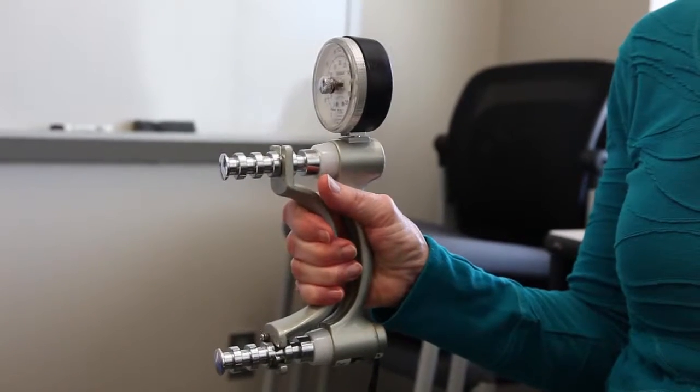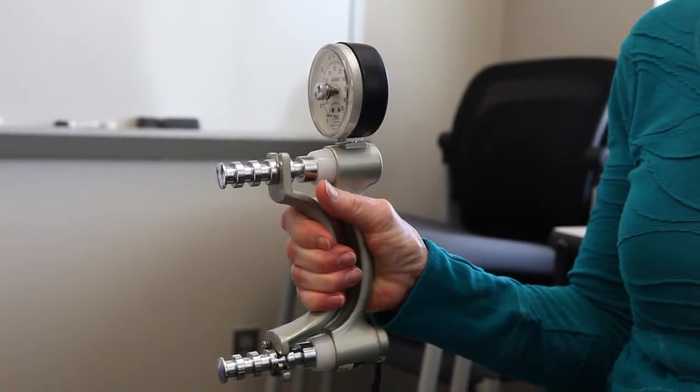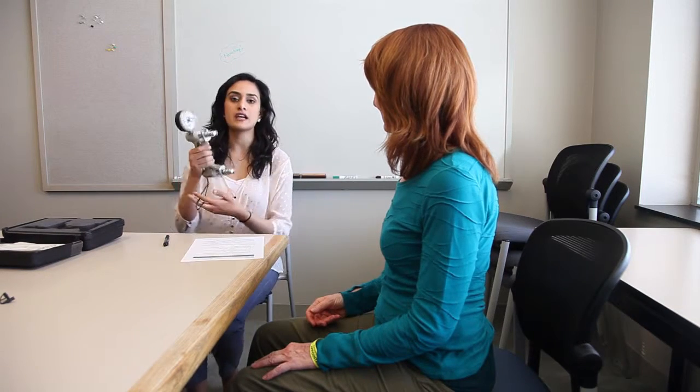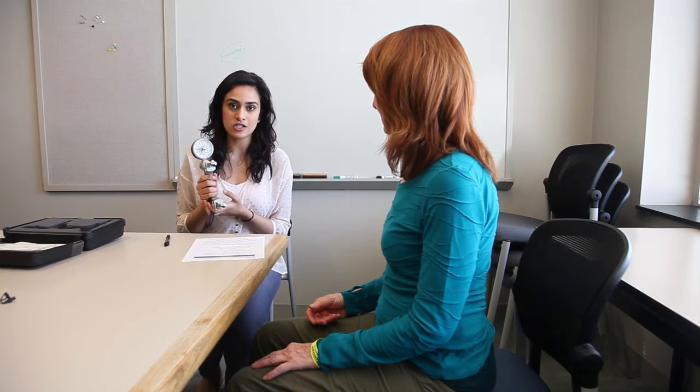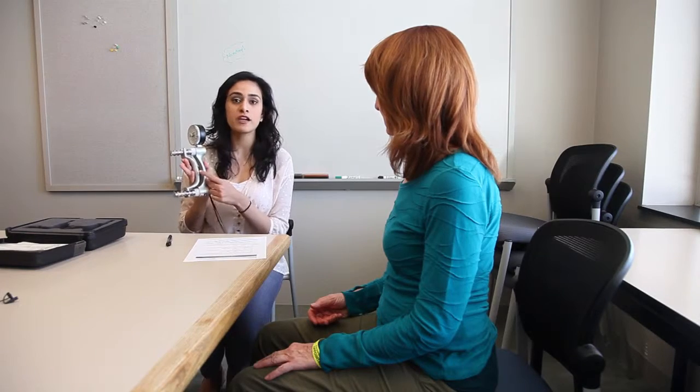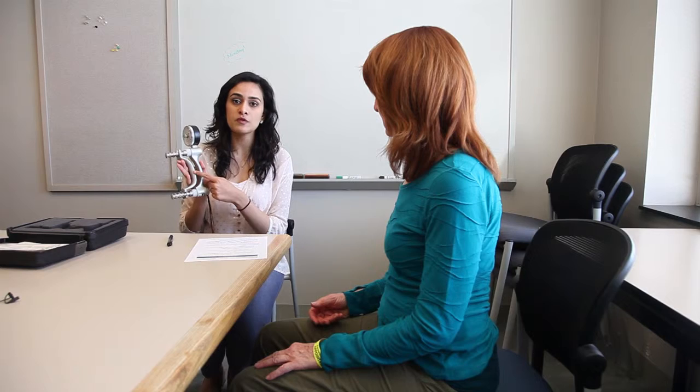Ready, set, squeeze, squeeze, squeeze, release. The dynamometer will give you a reading of the patient's strength. Please also let the patient know that when they are squeezing, the bars will not move, but the dynamometer will still produce a reading. The last component of the frailty assessment tool is the walking speed test.